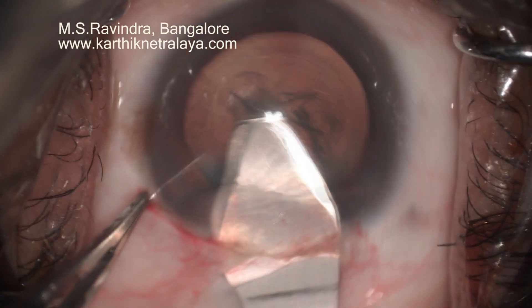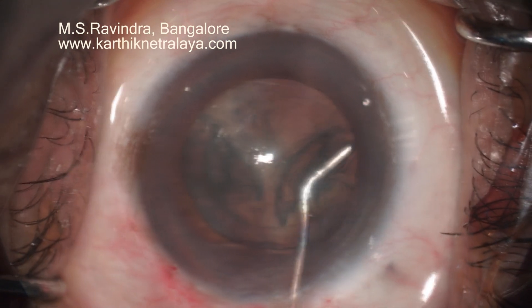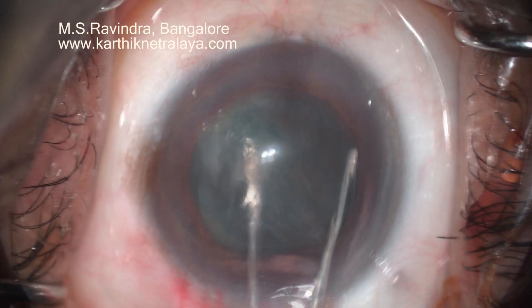Without wrinkling the cornea, you can do the entire rhexis. The width of the rhexis is about 5.1 mm. As you saw, I use one of the keratome to measure the width of the rhexis.